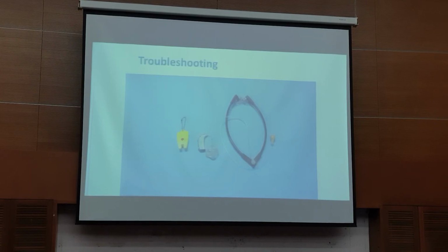Kalau start dengar sound quality macam bunyi dalam air, it shouldn't be, then you know there's something wrong with this hearing aid. And we also ask parents kalau boleh beli benda ni so that they can test it every day. And then they will know. Or cikgu sekolah, it will be good as well to check it. Alright? This is the last one.